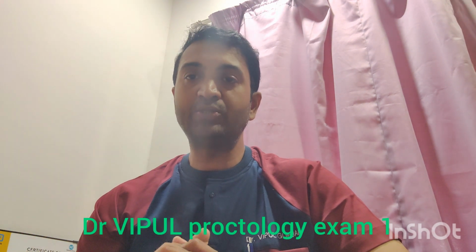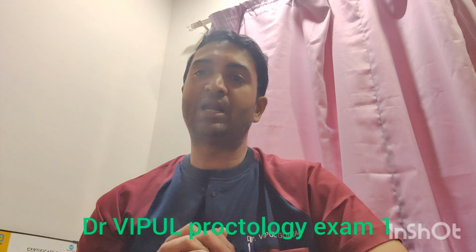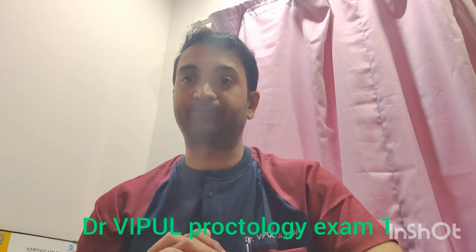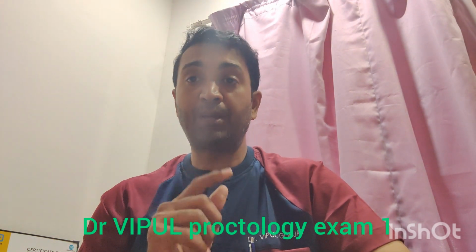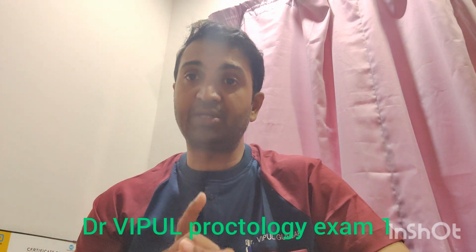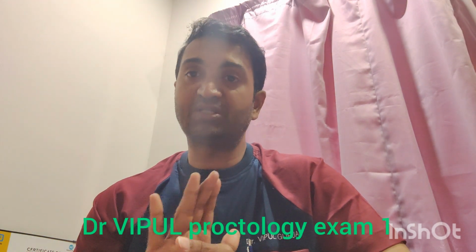So I advise you to use the knee chest position, with full flexion of the hip joint and knee joint, and try to touch the knee up to the abdomen level. Then you will get a good exposure. Otherwise, the proctoscopy examination, perianal examination and local visual examination will not be sufficient.